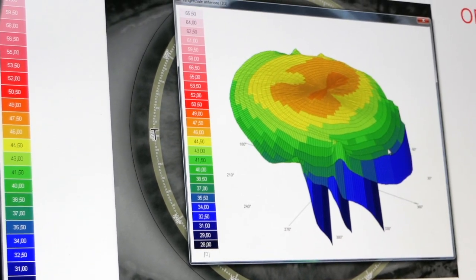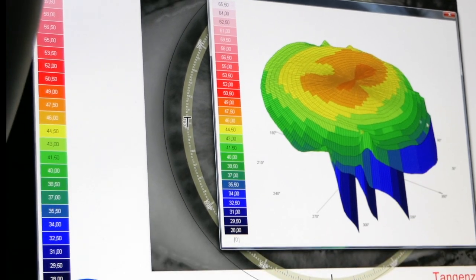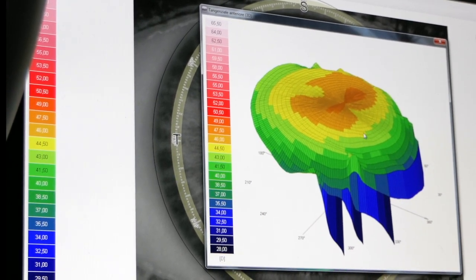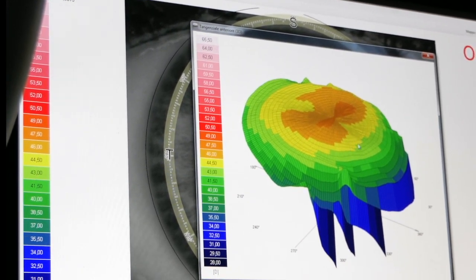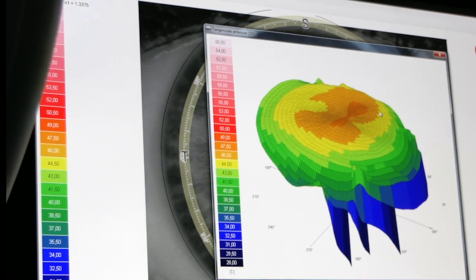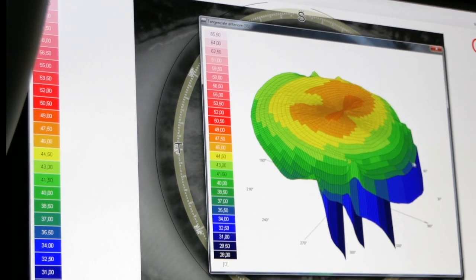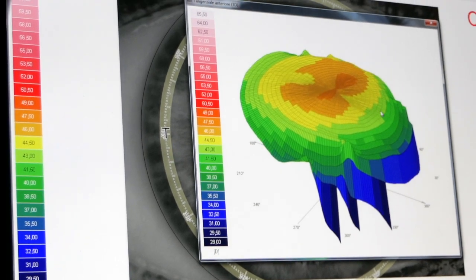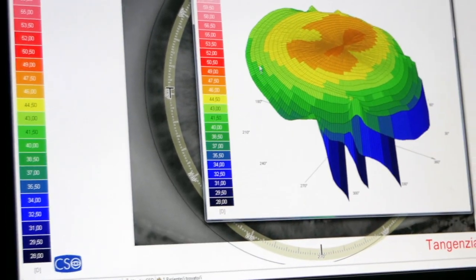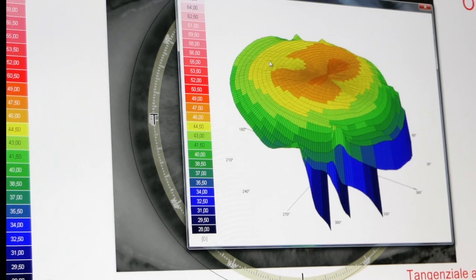Looking at it in three dimensions, we see that this part is flatter and this is more curved. And this has the purpose of making the cornea aspherical, not spherical. It is not an ideal sphere, but more curved in the center and flatter in the periphery.